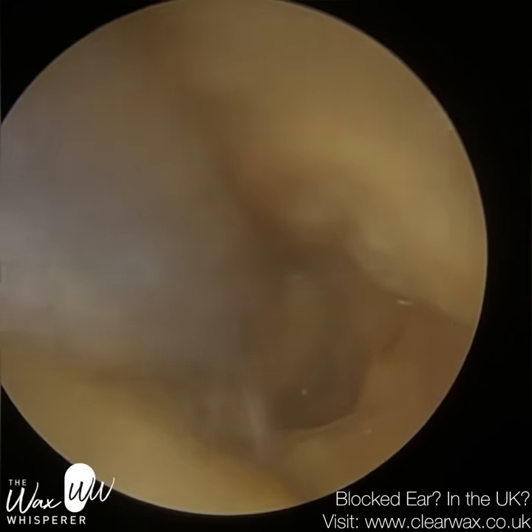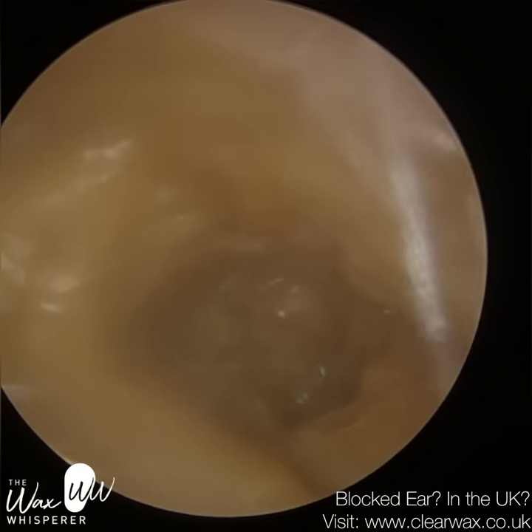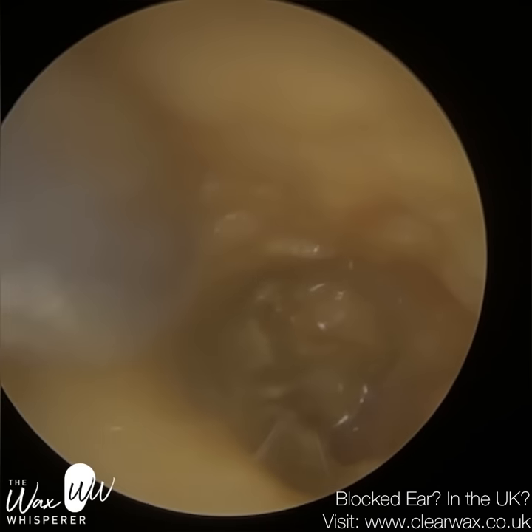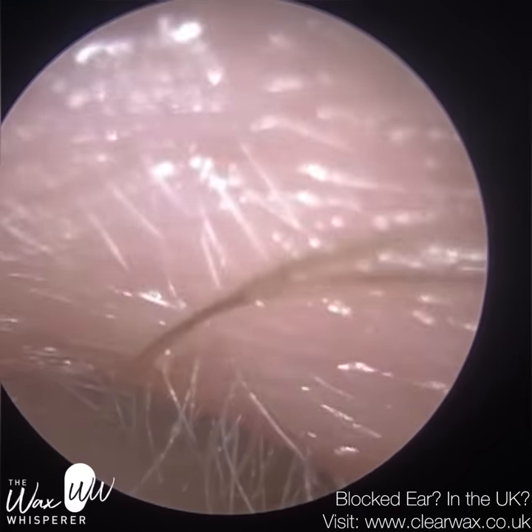What I'm trying to do here in the first part of the procedure — I just want to reveal their eardrum. That's why they've come; they want to hear. Everything around the edge is secondary, that's all a bonus. I just want to visualise their eardrum and I want this patient to hear. So I'm just going straight down the middle.